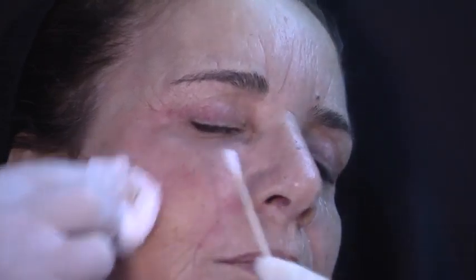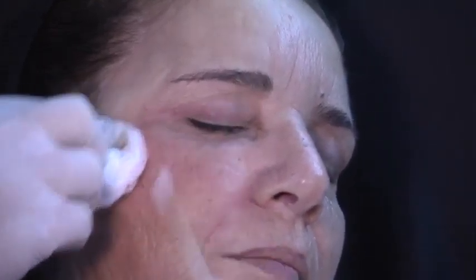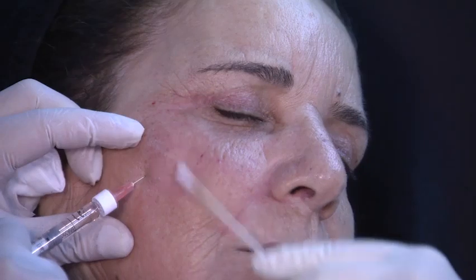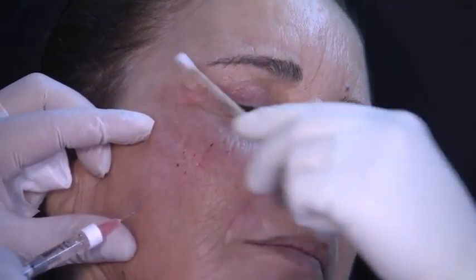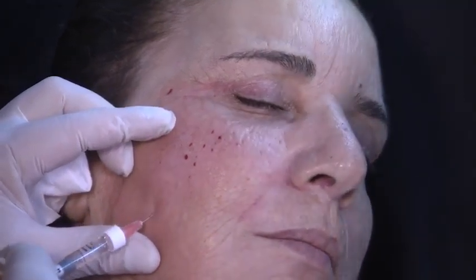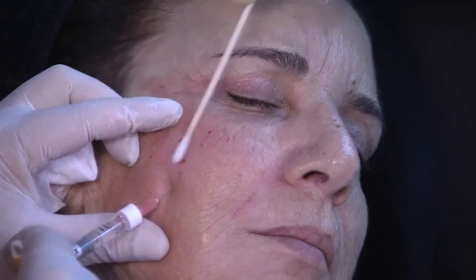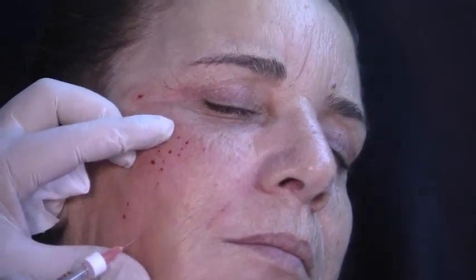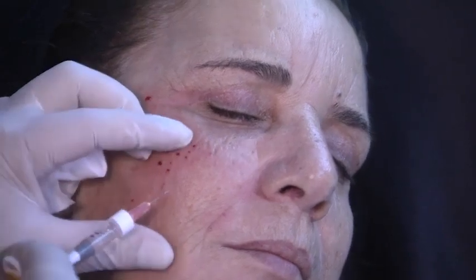So also in this area, when you have deep crow's feet, you can also use it, but remember the aim here is not to see a blanching or a lump. If I see a lump or something, I need to stop and take care of that lumping immediately, because if you go through days and you see that lumping, it might be very difficult to get rid of it. And how would you take care of those lumps? I just immediately try to mold and make those things disappear. So you make sure that she doesn't go out of your office with those lumps. Exactly. So right, I can do all the cheeks. So I'm going every centimeter, 1 click.